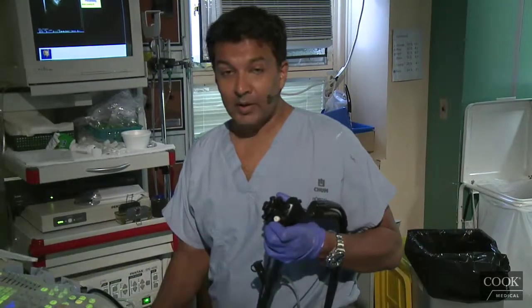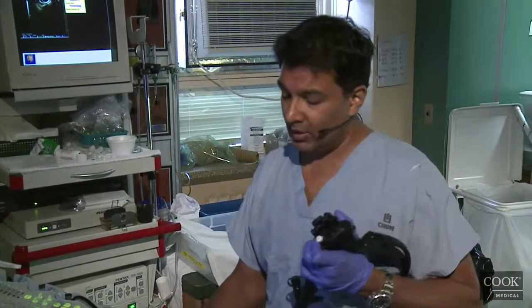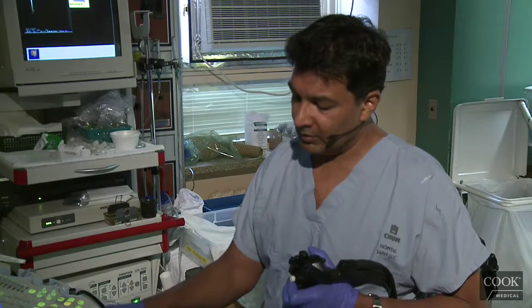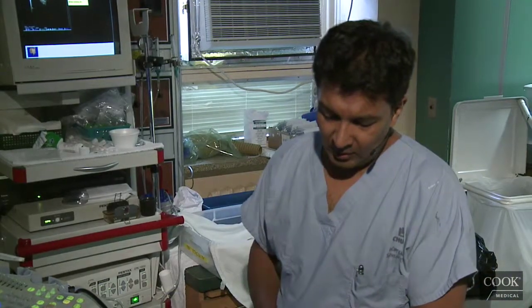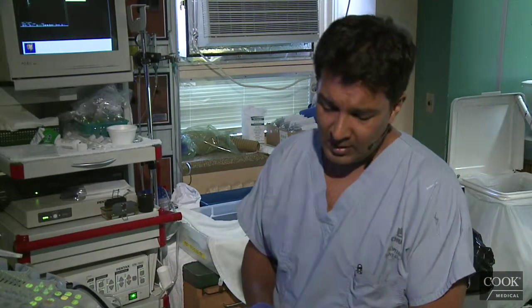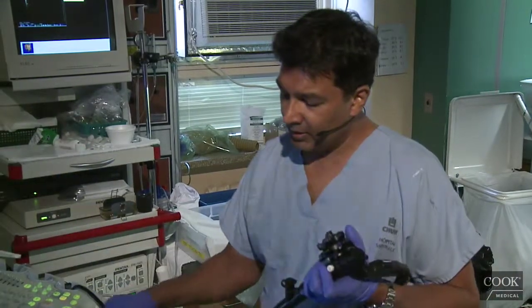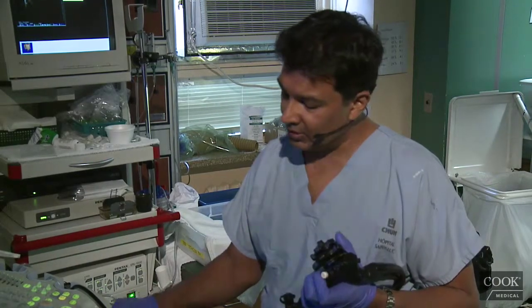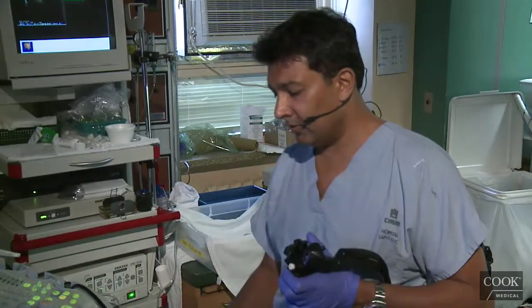This is another case of a lady with a lung lesion, no histology, but very suspicious for lung cancer. And she has mediastinal and abdominal nodes under the liver. I find it's pretty rare to get abdominal mets with lung cancer. It's possible. And I also find that it's pretty rare to find occult liver mets with lung cancer. I don't know why. You find it more with esophageal cancer, pancreatic cancer. But for some reason, the lung cancers, if the CT is negative, you tend to not find anything else on the EUS. So here we go.